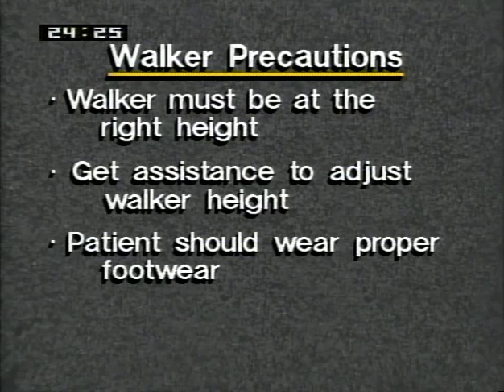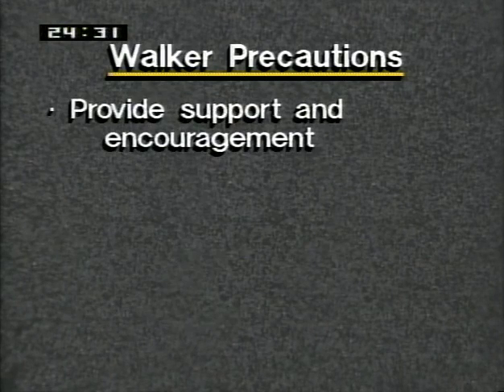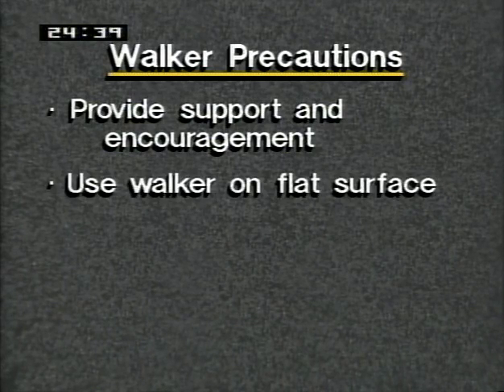The patient should wear proper footwear. Be sure that all obstacles to safe ambulation are removed. Provide support and encouragement, but don't rush or distract the patient. Encourage him to move slowly. A patient should use the walker on a flat surface with proper lighting. We don't recommend use of a walker to go up and down stairs.